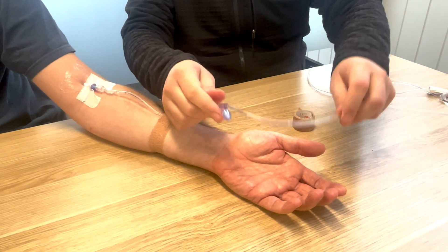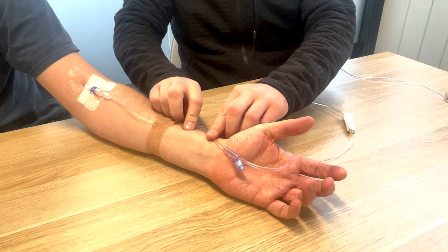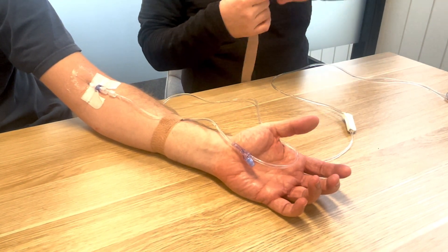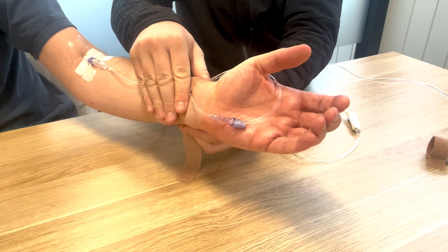Now I'm going to take this around the thumb over here — keep this loose so you can actually access the port as required. Larger piece of Coban or a larger piece of tape, forearm up again — there we go — around both now.